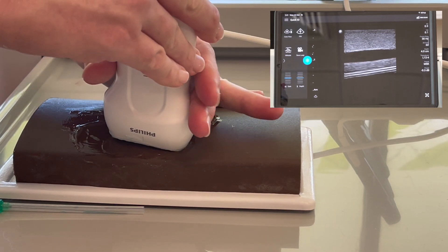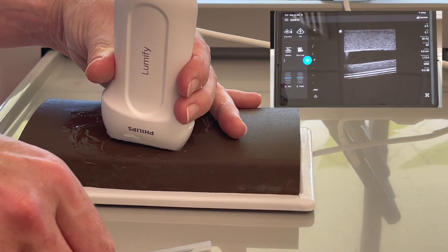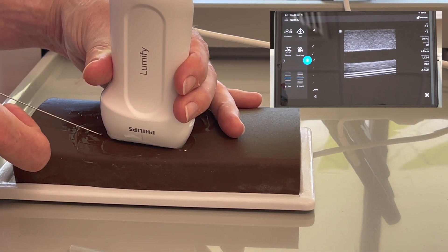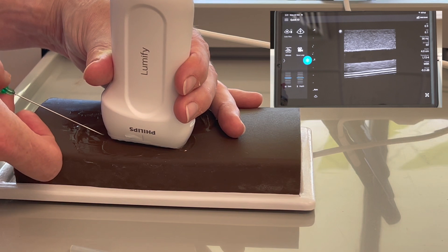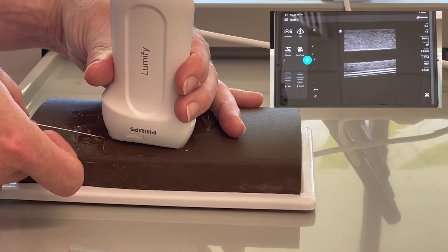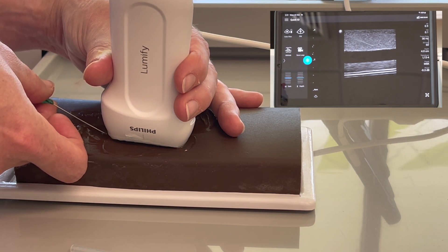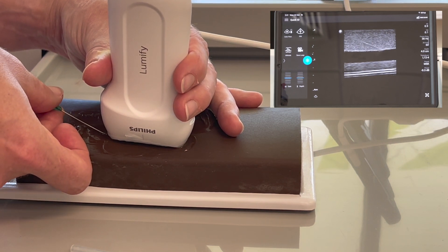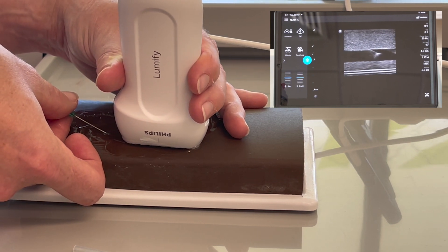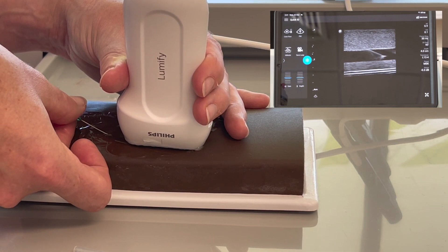For the in-plane technique, make sure you've got two well-defined vessel walls, starting a few millimeters back from your probe, watching your screen — you want to see a nice defined needle tip. You can see I'm approaching from the left side of the screen, and I've just entered the vessel. I can slide a little bit further, giving a nice defined view of the needle tip and needle shaft.